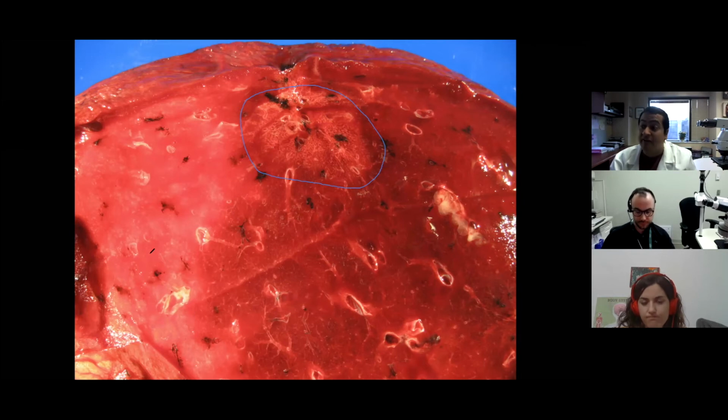Yes, absolutely. I've even seen micropapillary that looks ground glass like that. Just because something is ground glass radiologically doesn't mean it will be lipidic pathologically. The correlation is not that perfect. No, it's not perfect, like in everything else in pathology.